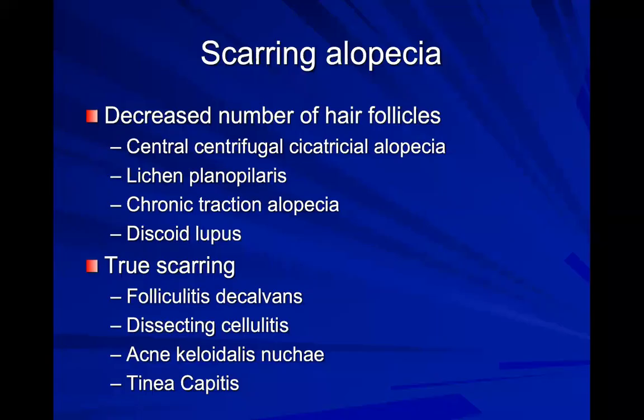All right, so that is non-scarring alopecia. And the take-home message is that you should understand and be able to identify what a catagen and a telogen hair looks like, this little process of it going up and down the elevator, and how the ratios are what matters most in making those diagnoses. That's why horizontal sections are preferred, because they're the only thing that can really give you a ratio, though you can often make the diagnosis on vertical sections.